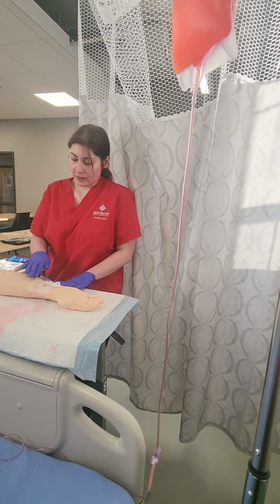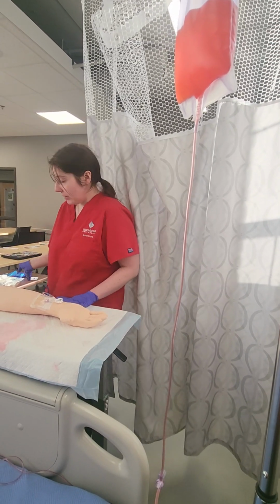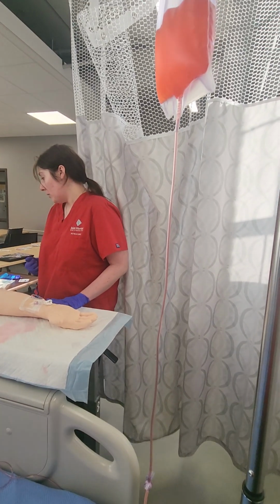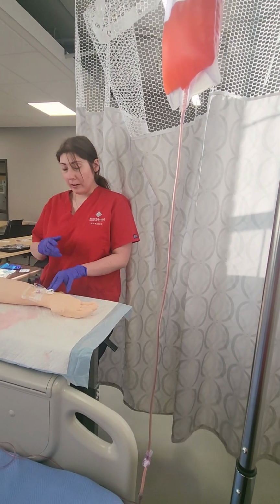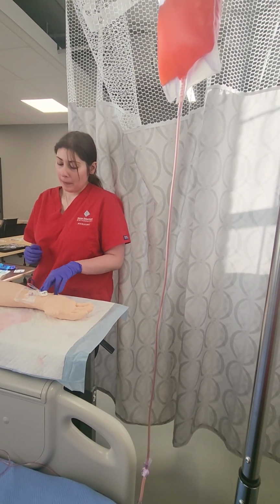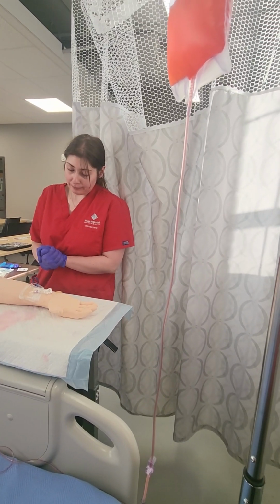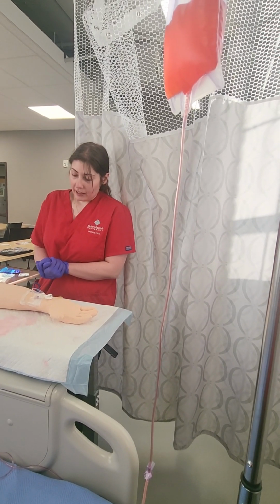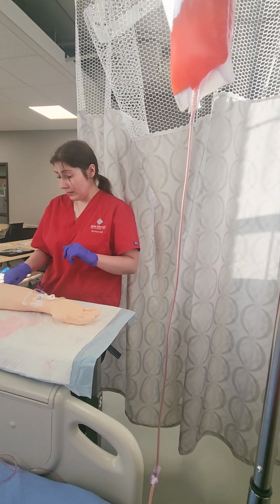that there is, you know, no infiltration. I got aspiration back, how much saline I put in, how much drug I administered, how you tolerated that, and all the teaching that I did, as well as that you did very well.